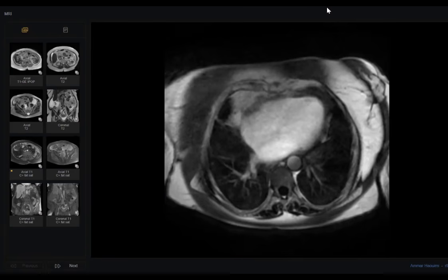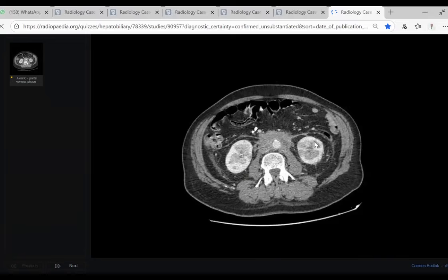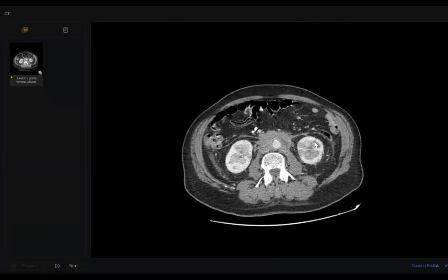In case of biliary injury, we give Primovist and we wait for 60 minutes. Why? Because we want to give more time for contrast to leak from the biliary injury and accumulate in a considerable amount that we can detect by MRI.